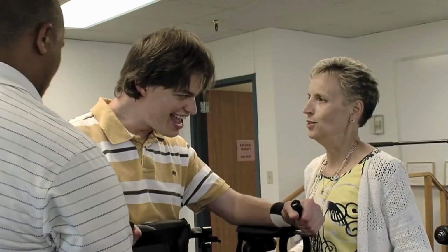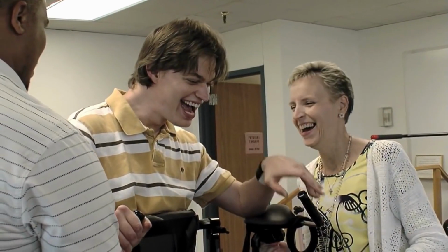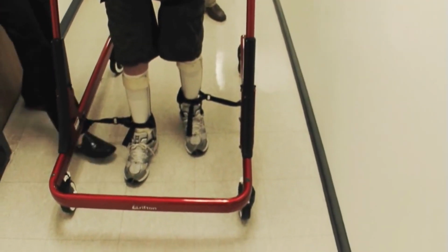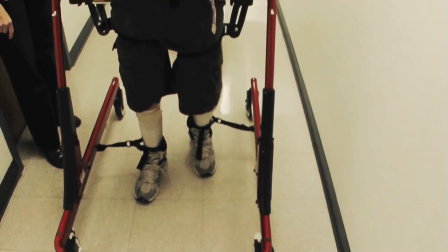He has limitations in his body. He's tight in some places and stiff, and it's different than before his injury. So now he has to learn how to move his body with those limitations. So the Gait Trainer is a great tool because it gives him stability while he learns to move in his new body, so to speak, because he really hasn't had the chance to do that since his brain injury. Don't pick up that other one until you feel all the weight on this foot. That's it. Now move it.